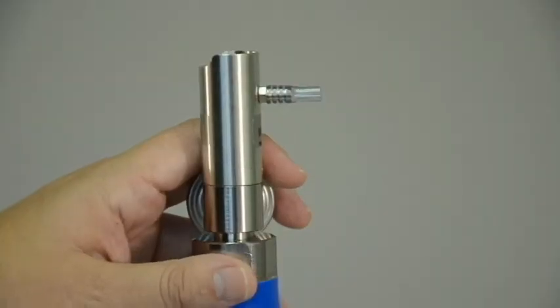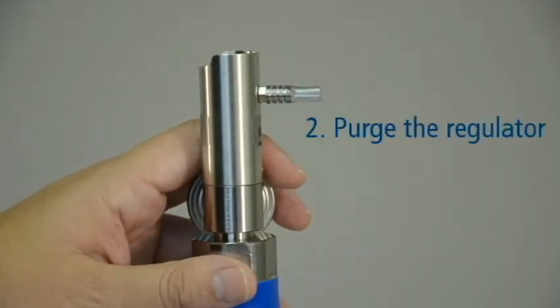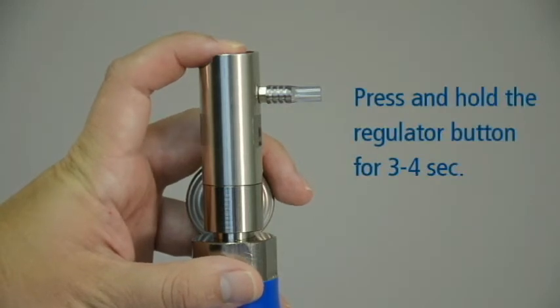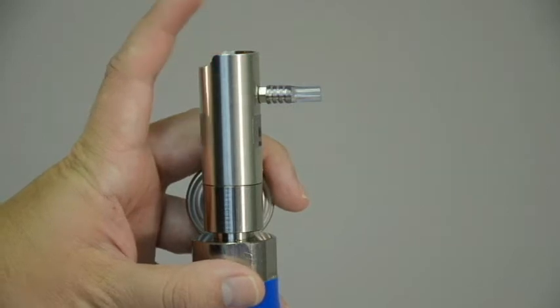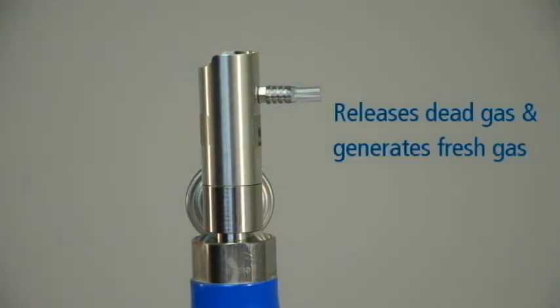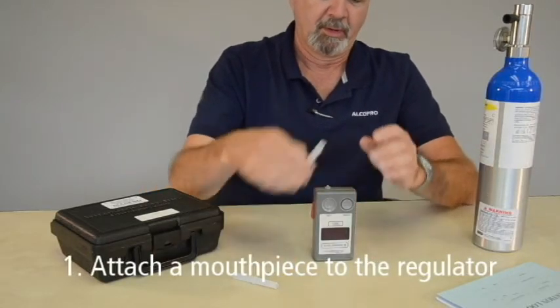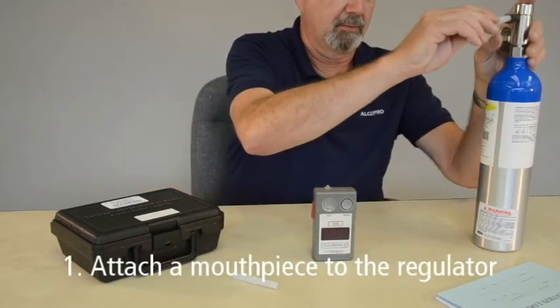Before performing the calibration, it is important to purge the regulator. This is done by pressing and holding the button or valve on the regulator for 3 to 4 seconds. Purging the regulator releases any dead gas that may be present in the regulator and generates fresh gas for the purpose of the calibration. Next, attach an AlcoSensor 3 mouthpiece to the regulator tube.